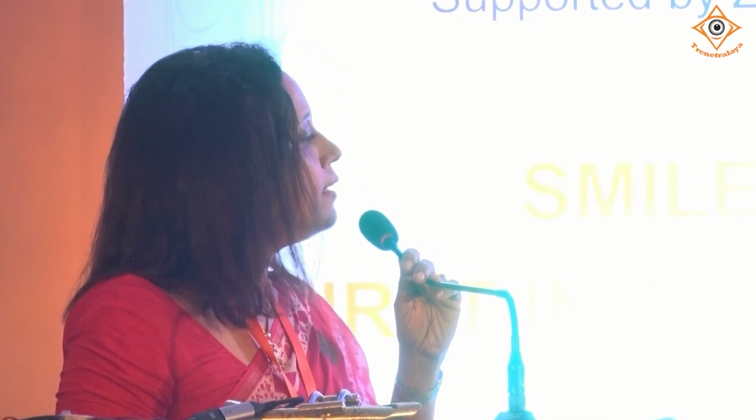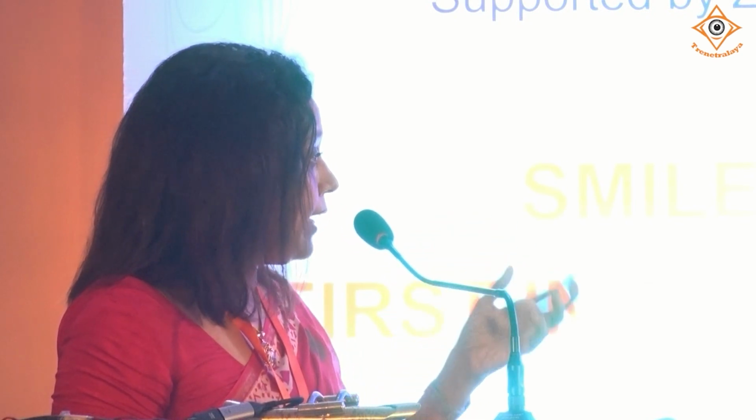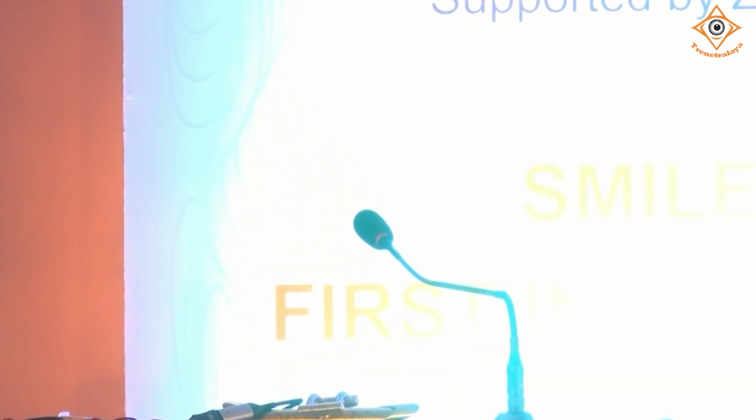The dictum is that if the conjunctiva is abnormal, that is a cicatrizing conjunctival disease like ocular cicatricial pemphigoid and Stevens-Johnson, it is better to do a clear corneal. If it is a corneal pathology like, say, PUK, etc., then sometimes we prefer to do a scleral tunnel. But in cicatrizing conjunctivitis, it is better to do a clear corneal. If visualization is a problem because of scar, then maybe use a light pipe or a chandelier illumination to help you. And if nothing really works out, then maybe just do an extracapsular.